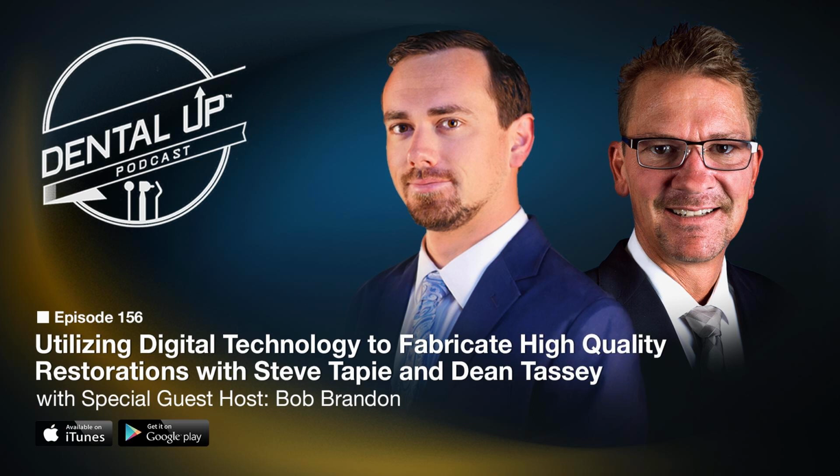Absolutely. And on the flip side of that, we can blow up preparations and finish lines to a very high level of magnification sometimes. And we're using that to communicate with customers. Which types of parameters or situations are you most commonly communicating with customers about? Well, I think the area that we most communicate about is margin marking. It can be a little difficult at times to pick out a solid margin on a typical PVS impression. But with the intraoral scans, like you said, you can blow up the prep to be the size of an 18-inch monitor. It's very easy to see any areas that might give you a problem down the road.